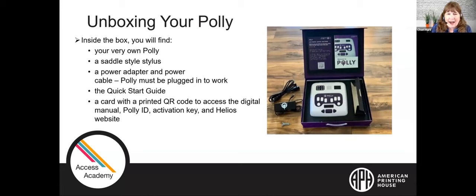When you start unpacking it, there are a lot of things in the box. You're going to find the Polly itself, a saddle style stylus, and a two-piece power adapter cord. The Polly does need to be plugged in to work — it does not have a rechargeable battery, which was a cost-saving measure. You'll also find a quick start guide with simple, easy-to-follow directions. The last piece is a card with a printed QR code that gives you access to a digital manual, the Polly ID, an activation key, and the Helios website.